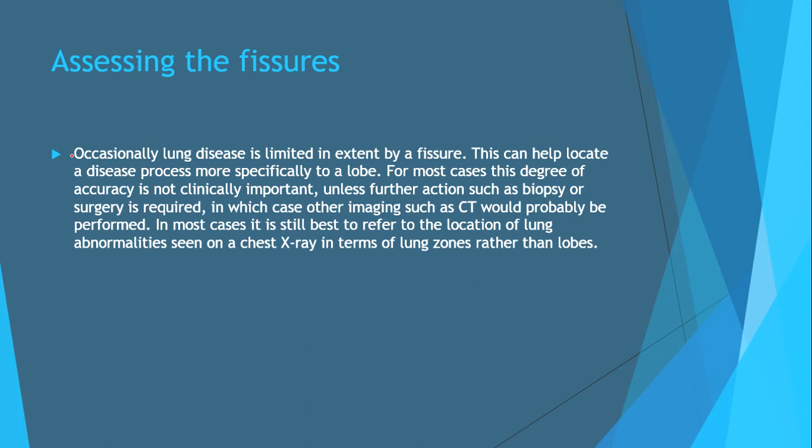In most cases, it is still best to refer to the location of lung abnormalities seen on a chest X-ray in terms of lung zones rather than lobes.